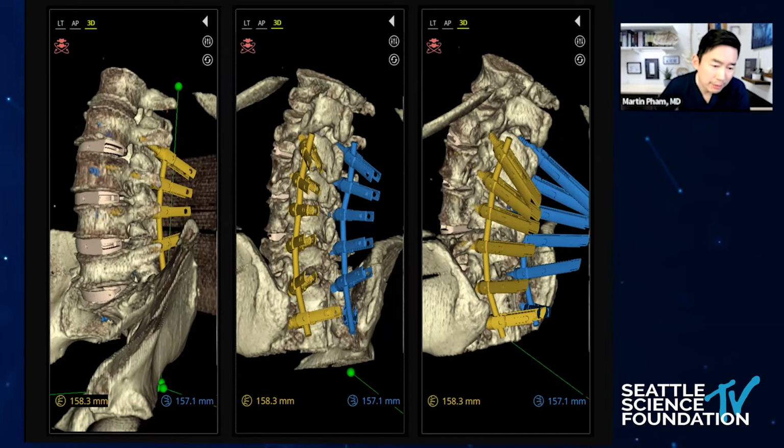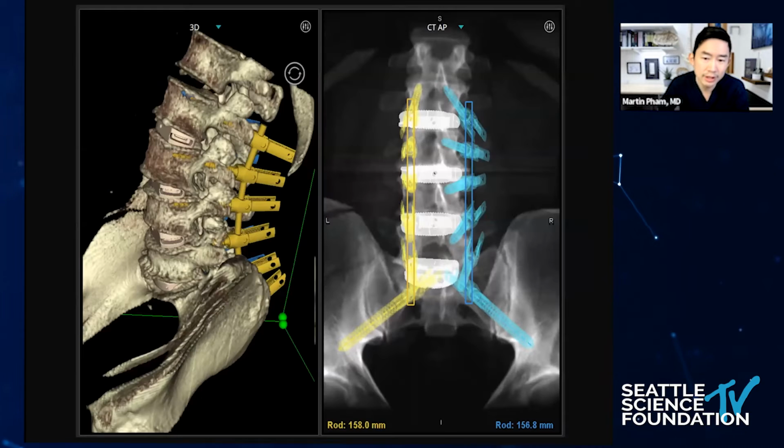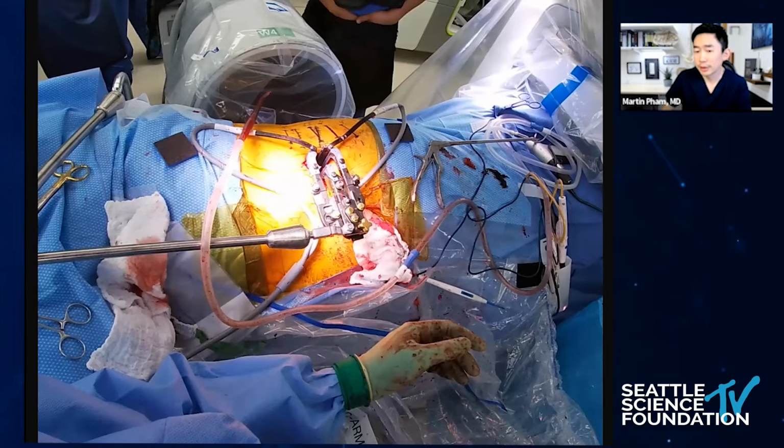It's just a weight off of my mind that even though I'm putting in an L5-S1 cage, I won't halo out my S1 screws, and I protect them with iliac fixation. And really now, one of the biggest reasons is that I can, right? We can do it in single position.